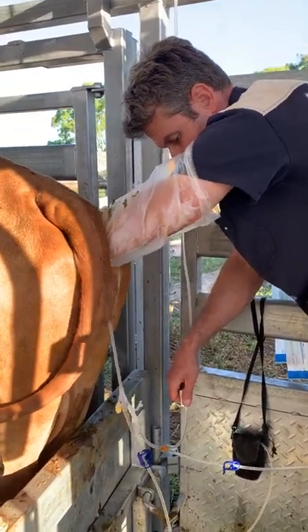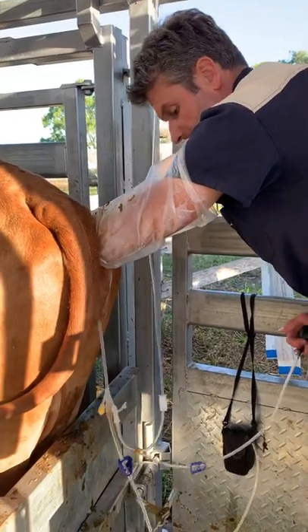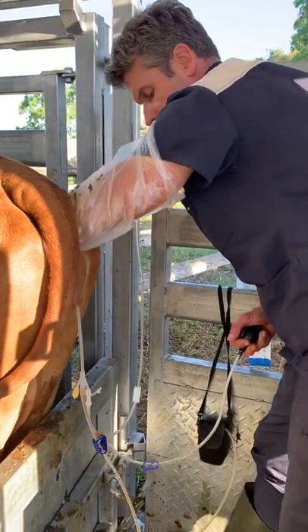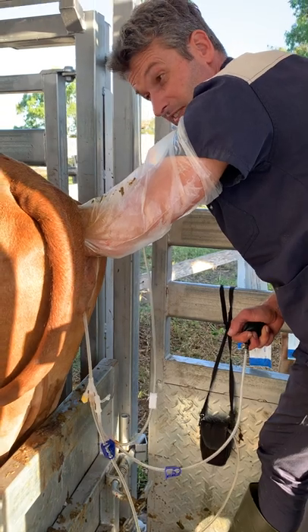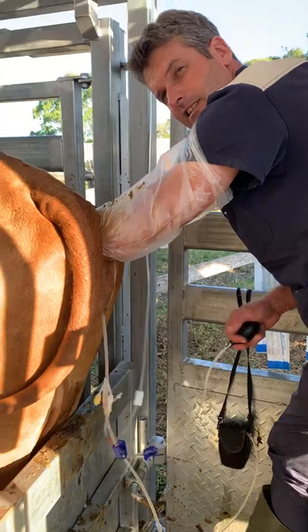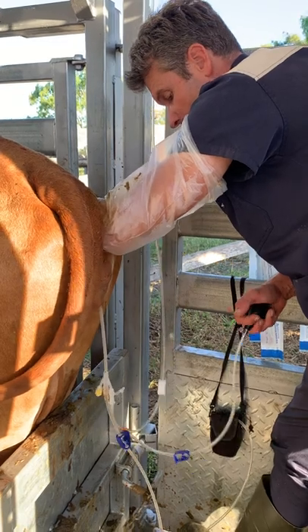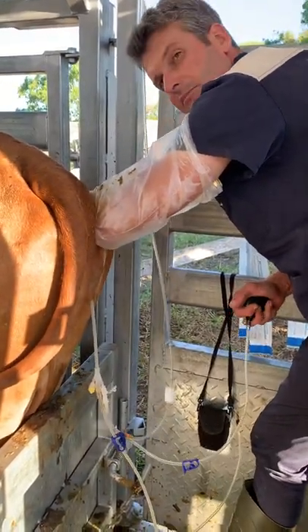So she had seven ovulations? Yeah, on each side — so 14 all up? Yeah, around about. It's hard when they're that big to really count all of them. But the ovaries responded quite well. She has got two cysts on the left-hand side which I've popped, and that's probably also a reason why her uterus is a bit thickened — still estrogen that thickens the wall up. But if we have more progesterone dominance than estrogen, we still get the embryos.